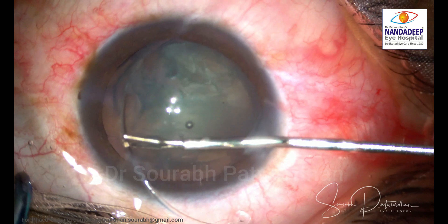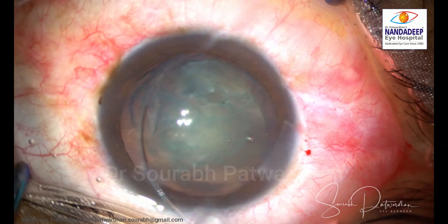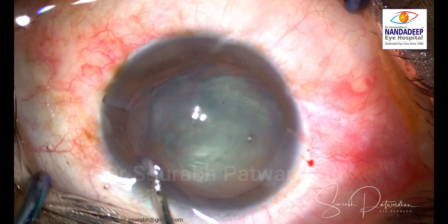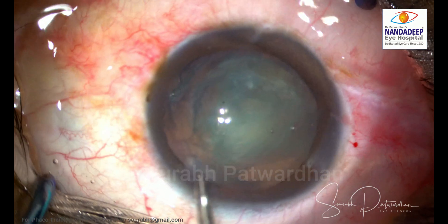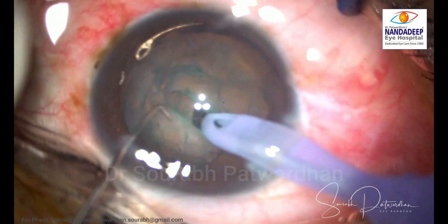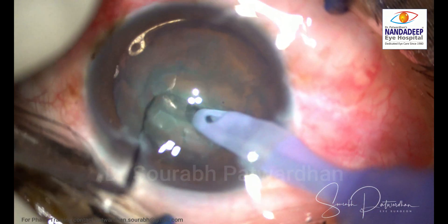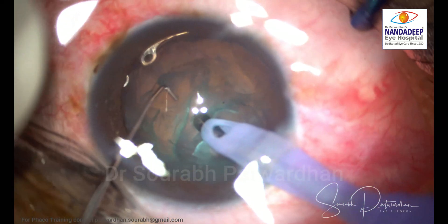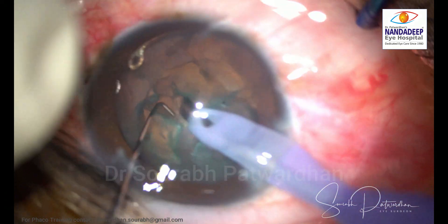As I insert most of it in the bag, I will go from the side incision using the same forceps, holding the CTR near the eyelet to push it completely into the bag. The area where I release it is the area of subluxation. As you can see, in the area of subluxation both eyelets are closed together and they give quite enough support for that area.